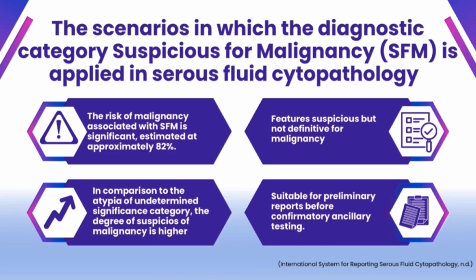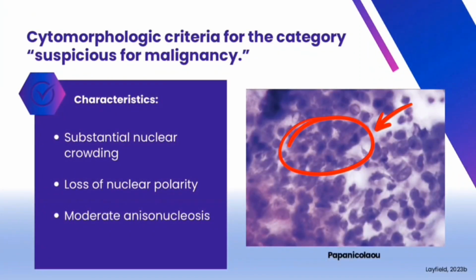They can lead to an upgrade to a malignant diagnosis or a downgrade to negative for malignancy. However, if results are non-contributory or insufficient material is available, the diagnosis may remain as SFM. Next is the cytomorphologic criteria for the category suspicious for malignancy.